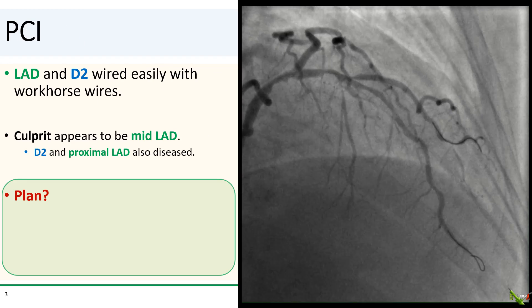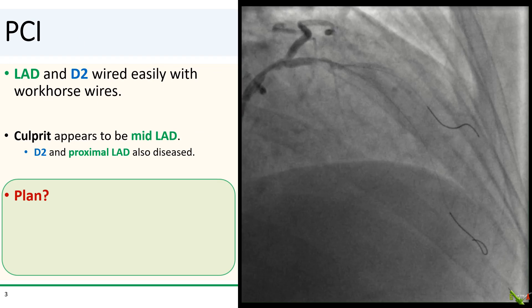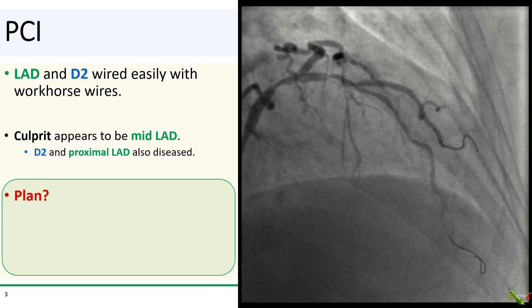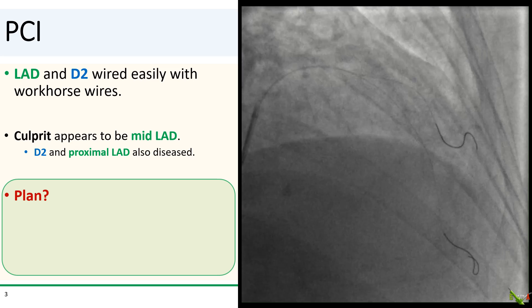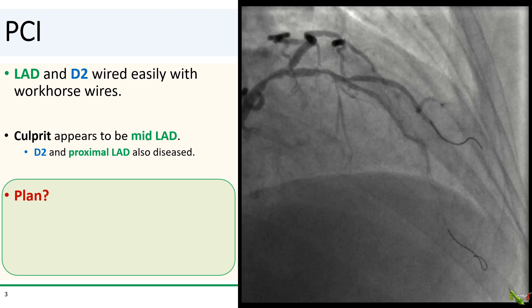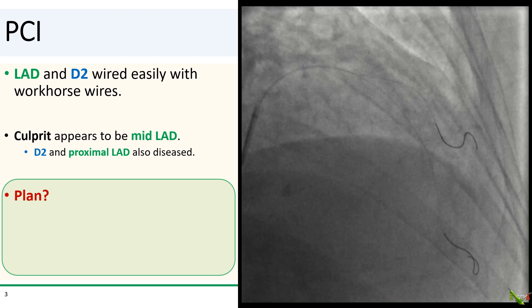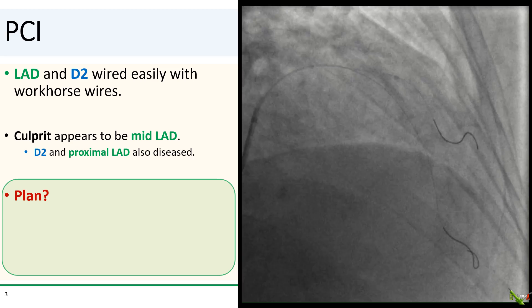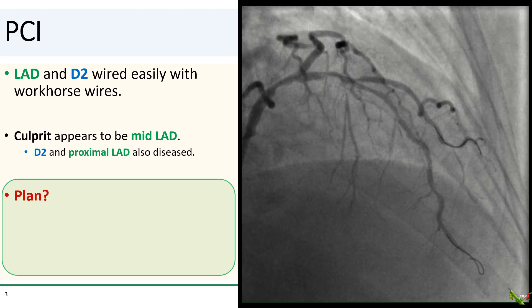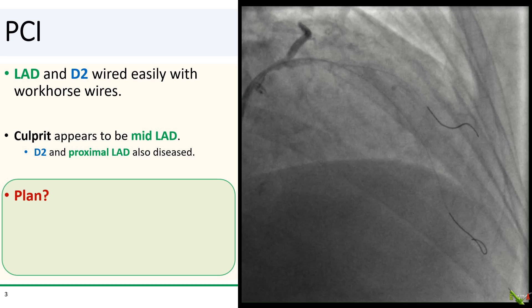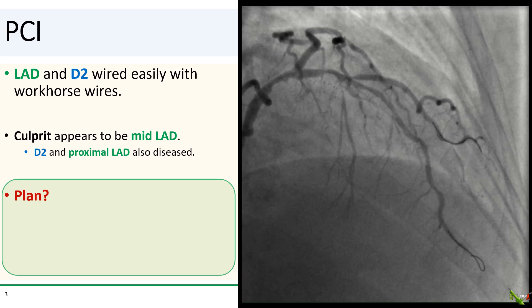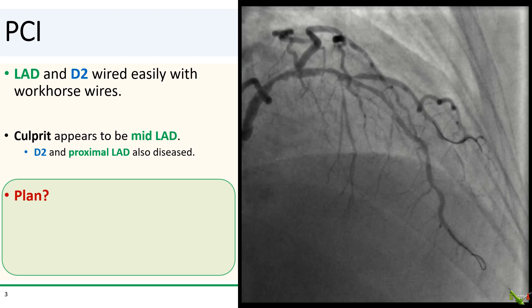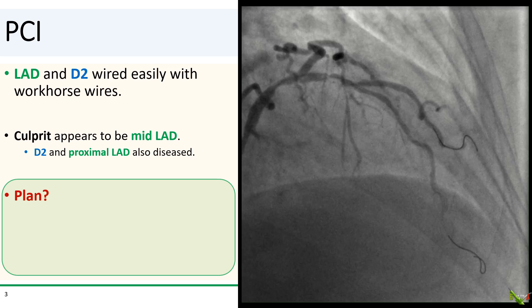The LAD and diagonal were both easily wired with workhorse wires. In this view, you can see that the culprit appears to be the severe lesion in the mid-LAD, although the proximal LAD appeared to be diseased as well.